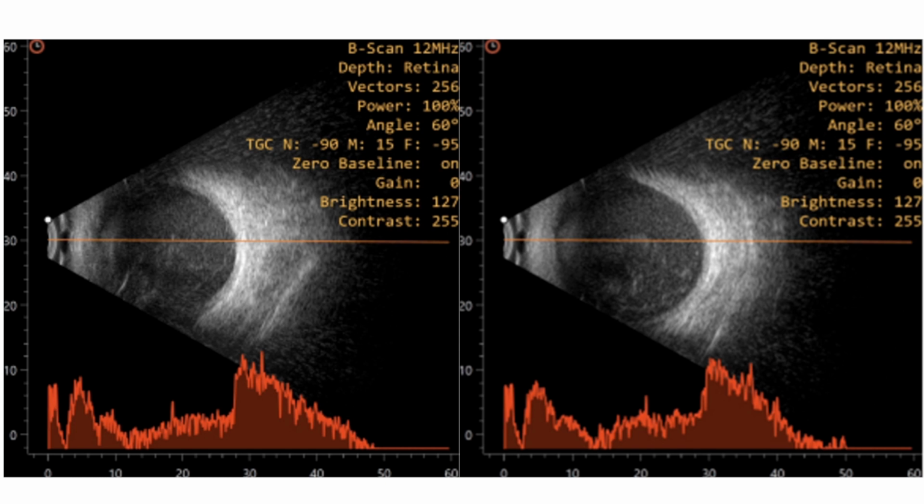The ultrasound was repeated after starting the topical steroids. The vitreous cavity showed plenty of dot reflectives. Devika, how many days later was the ultrasound repeated? These two I think you should tell. So it was the next day after hourly or 30-minute steroids. How was it? Ma'am, after 4 days of topical steroids, the ultrasound was repeated.